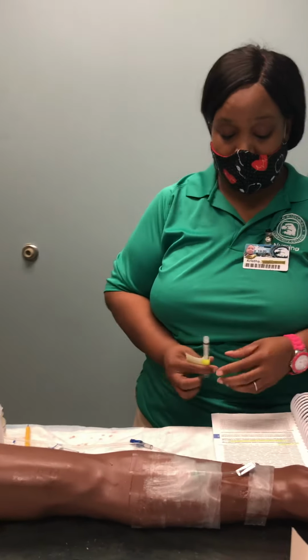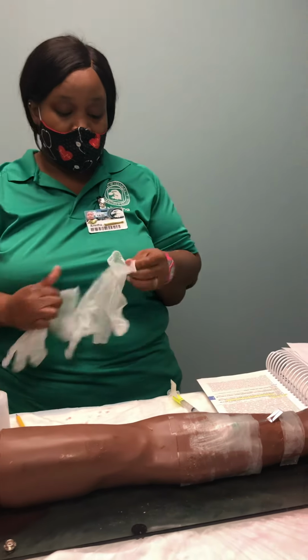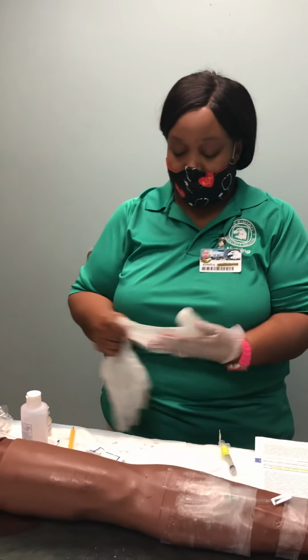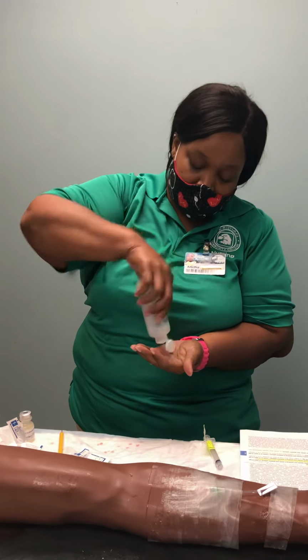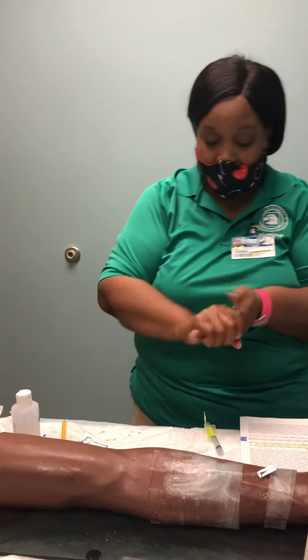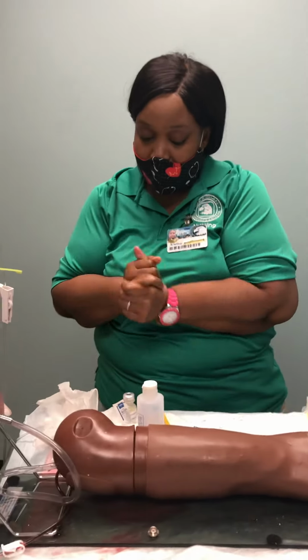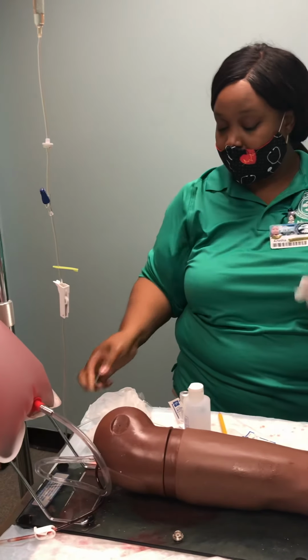Also, if this was an INT, I would wash my hands and put on my gloves.